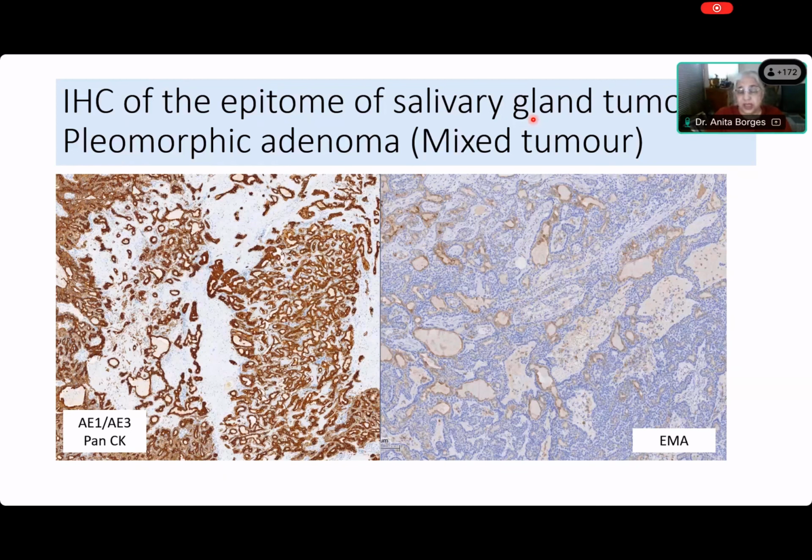The same matrix that you are seeing inside these cribriform areas. Do you notice that? So inside the lumina, you're seeing secretions. Outside this lumina, as well as within these cribriform spaces, you are seeing a myxoid matrix. So how did this happen? Akshara, can you explain that?